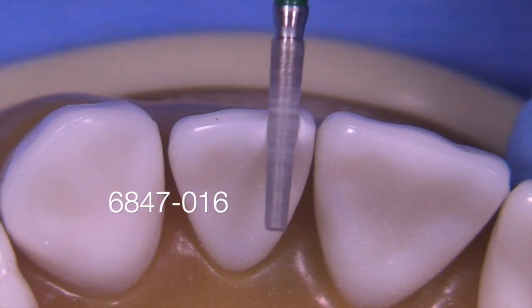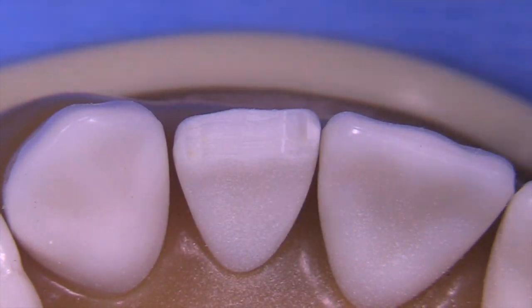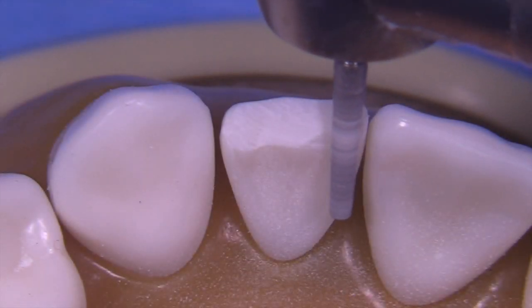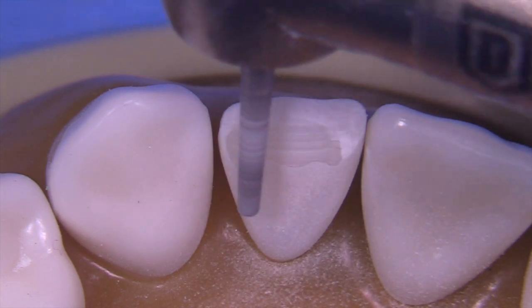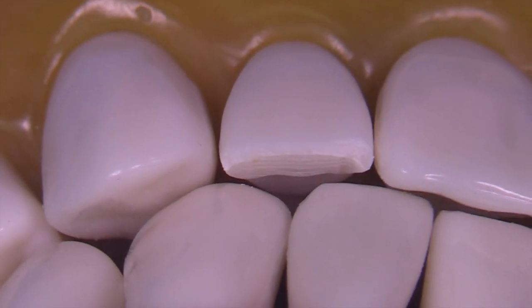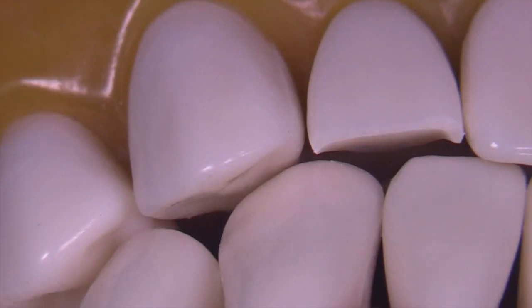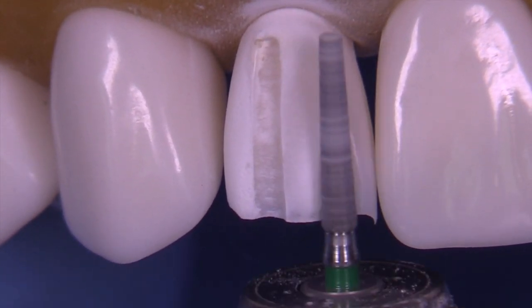We're going to start with the 6847 016, exactly like we did on the central in the previous video. The edge will be reduced flat; we're not trying to angle the bur at this stage. The bur is essentially at the angle from the lingual surface to the facial surface — perpendicular to the line of draw of the tooth. The challenge of getting enough lingual clearance means we need to steepen the diamond significantly to get at least one millimeter of clearance.